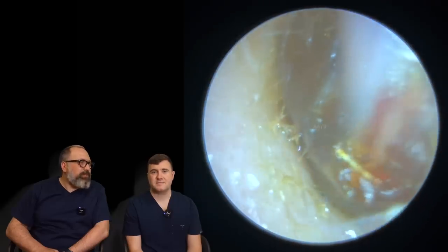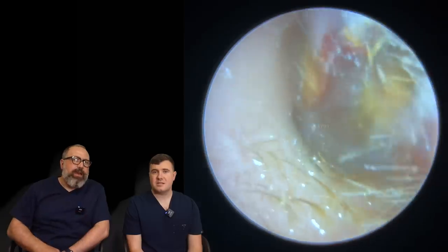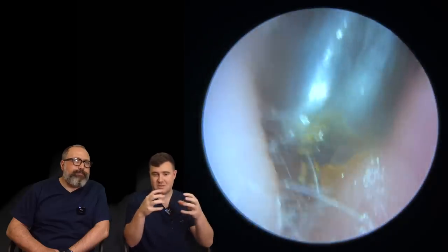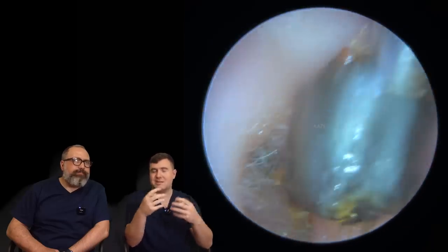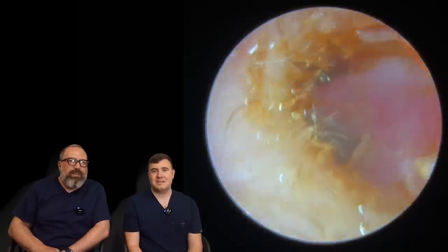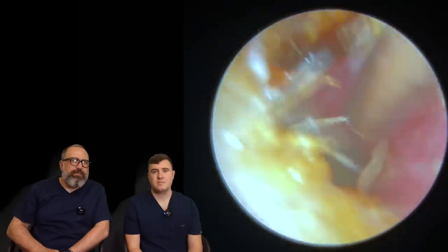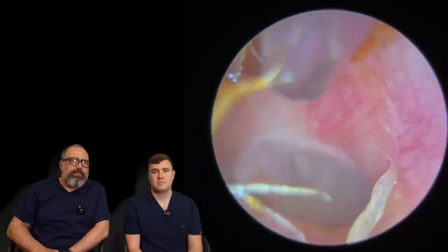It's the only downside of olive oil when using endoscopes — you get it from the cilia. It's like the hair in the ear; the oil sometimes sticks to it, and you try to avoid it but some people's cilia is quite long. You just can't get away from it, unfortunately. There are tiny little bits in here — a little bit of dry skin at the bottom and a tiny bit of wax at the top as well, so we're just going to get rid of those.